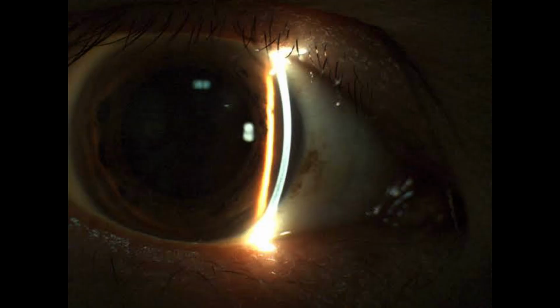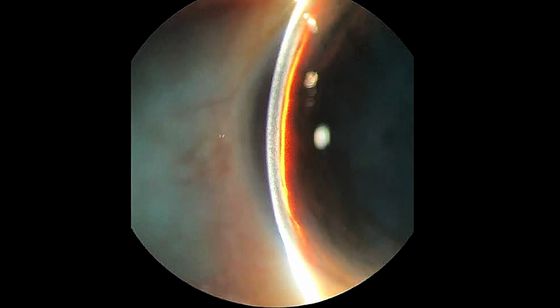Trivia time. What would you call this angle? Or how would you estimate this angle? Would you say it's a grade 4, grade 3, grade 2, grade 1, or grade 0? Let me know in the comment section. This is another picture I attached. Would you say this is a grade 0, grade 1, 2, 3, 4? Can you see a dark space in between the cornea and the iris?